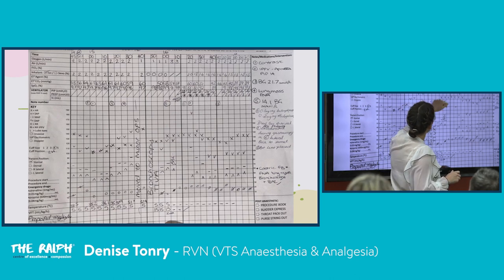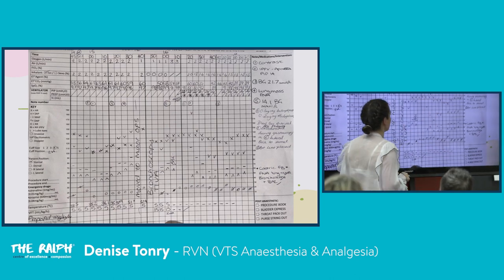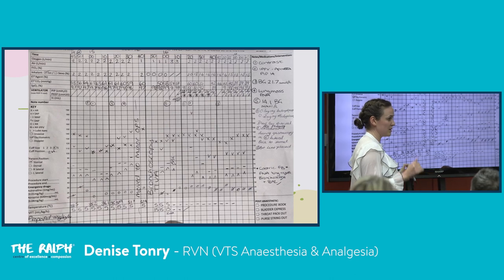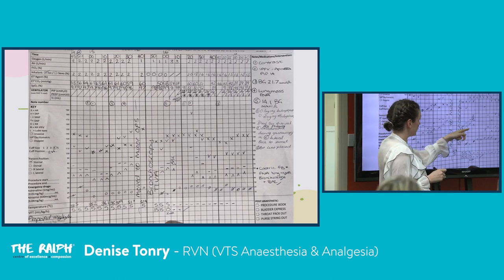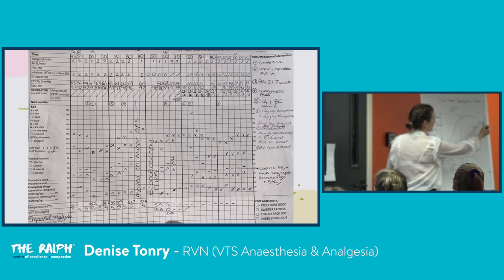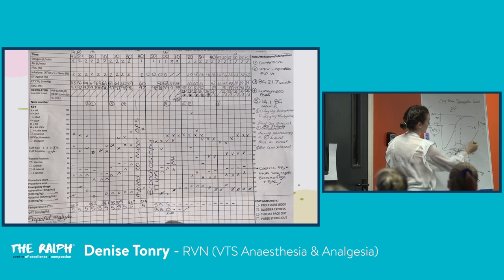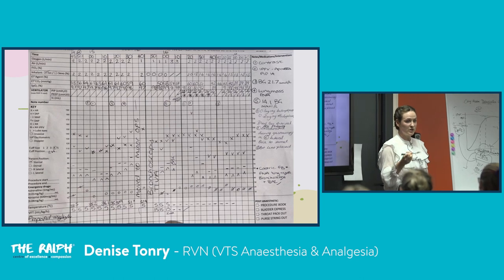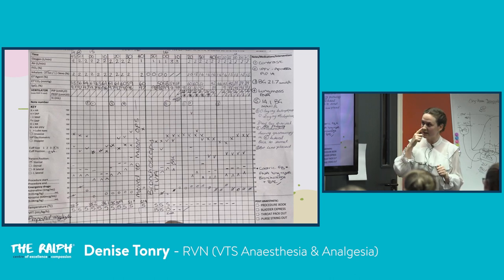In this situation, we employed mechanical ventilation, because I was IPPVing her and not achieving any rise in the SpO2. At this point, it's a bit scary. Why are we down to 80% when we're providing 100% oxygen? We should be up here at 500. Why are we somewhere down here at 80? This is the scary drop. When you're breathing room air, it's not that scary: you've dropped from 100 to 80, 20 millimeters of mercury, which doesn't sound dramatic. But when you're on 100% oxygen and you drop from 450 to 80, it gets unsettling.